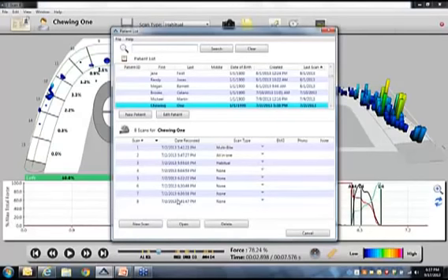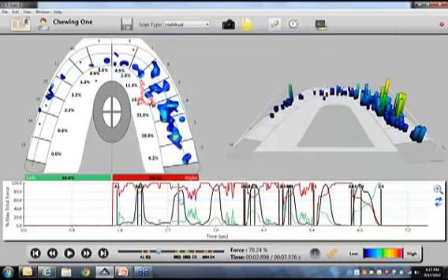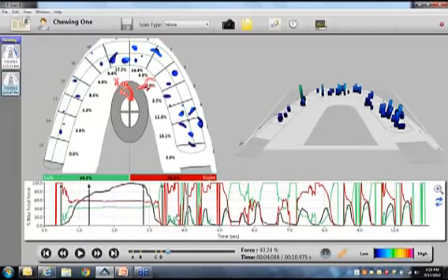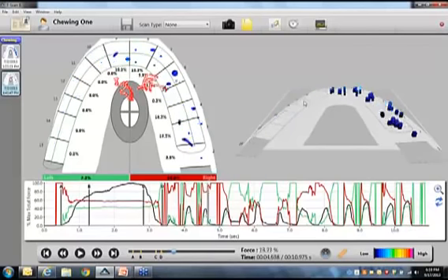And the end result for this patient, you pull it up, you'll see that we were able to achieve equalized group function on this patient. Now we do see a high force over here, and we noted that, but because the chief complaint was on the right side and chewing, we decided not to mess with that side too much. But you can see now the patient's chewing, it's a lot more of an equalized function. Patient felt a lot better immediately.